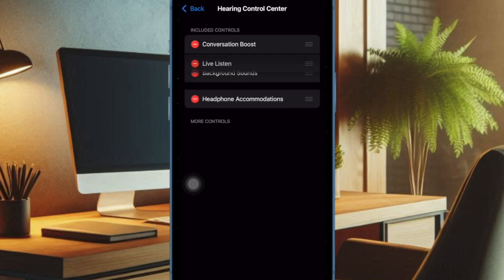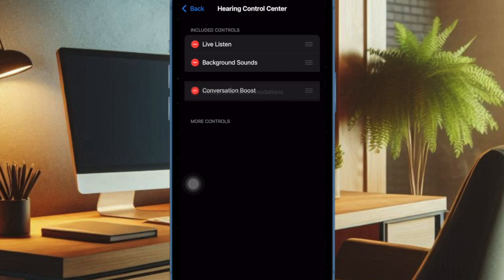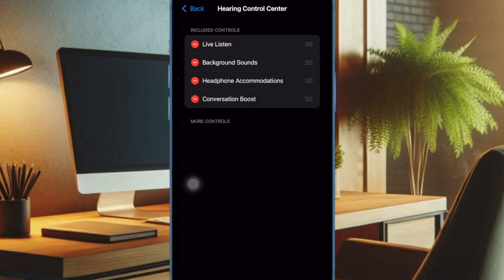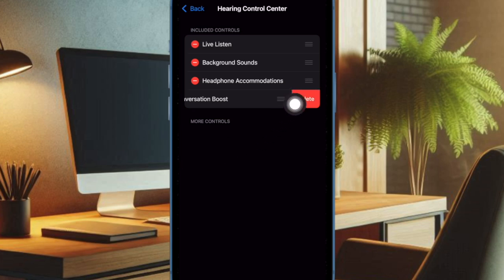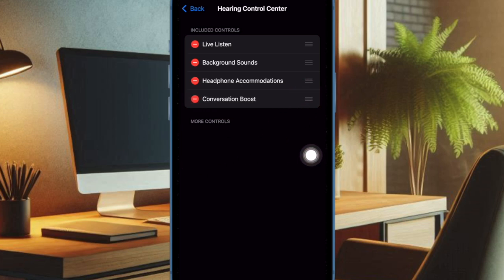If you no longer want to use a specific control, just tap on the red button to the left of the control, then tap on the delete button to remove it.